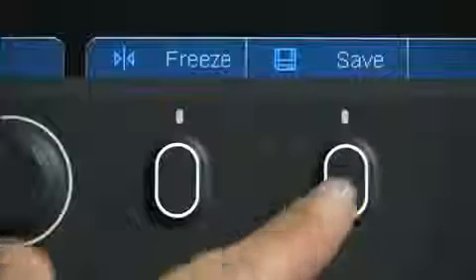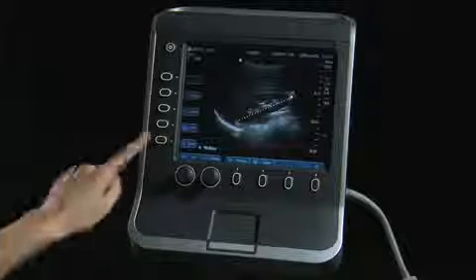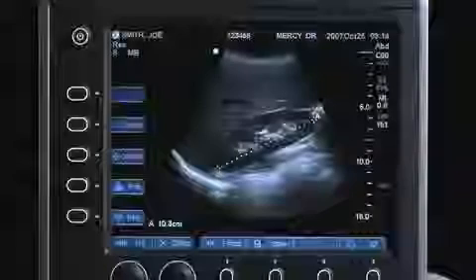Select Save to send the desired images to the internal storage of the system. Select Print to send the image to a printer.